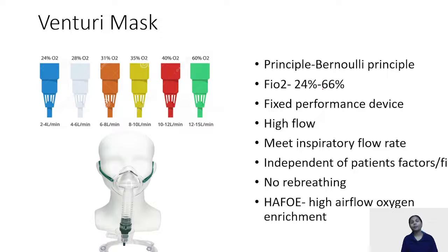See, the principle on which the Venturi masks are based on is Bernoulli's principle, which is a must to know and asked a lot many times in previous year questions. That is, what is the principle on which Venturi mask does work? That is your Bernoulli's principle.